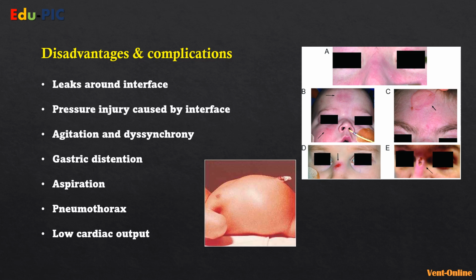weaned off it. Pneumothorax, as with any positive pressure ventilation module, even if it's invasive, is a complication that can happen anyway. And low cardiac output can happen due to increased intrathoracic pressure and intra-abdominal pressure as well. So that just affects basically the venous return. So just be careful when you're looking for these complications.